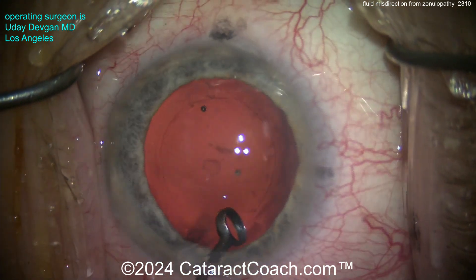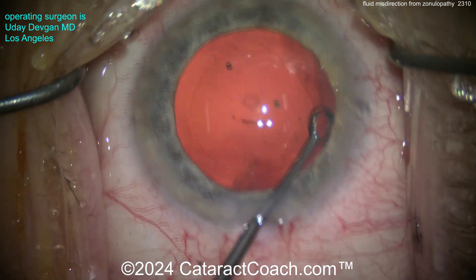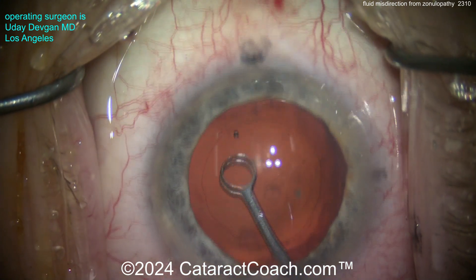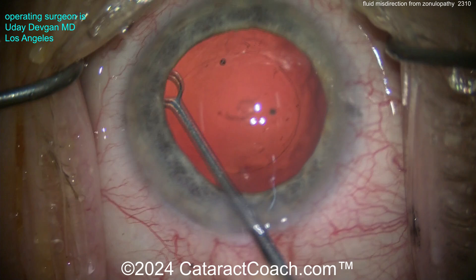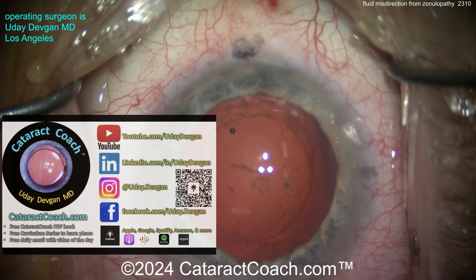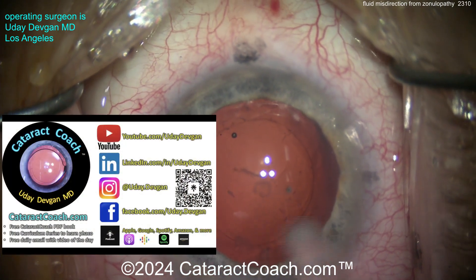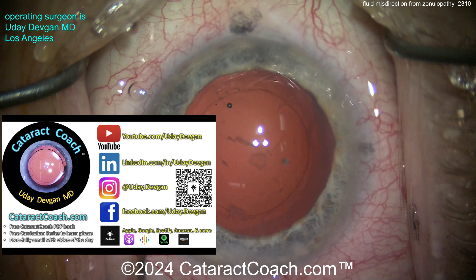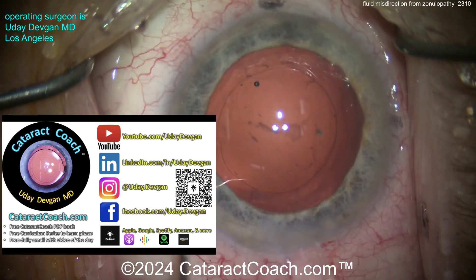With this fluid misdirection, we also noted — prior to me putting viscoelastic in the capsular bag — that the bag was shallowing. Think about why that's happening.